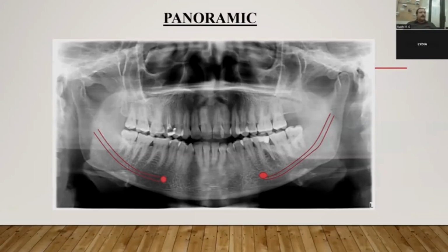Second thing is, you need to have sufficient diameter in this socket area to separate it from the nearby tooth as well, because 1.5 millimeters has to be kept away from the nearby tooth. So your implant selection should be of lesser diameter in this case, so that you'll have enough bone between the natural tooth on the other side and the natural counterpart root. So lesser diameter is favorable here. So you're planning for hemisection, a lesser diameter implant, but at the same time, the root you're considering here is a distal root.